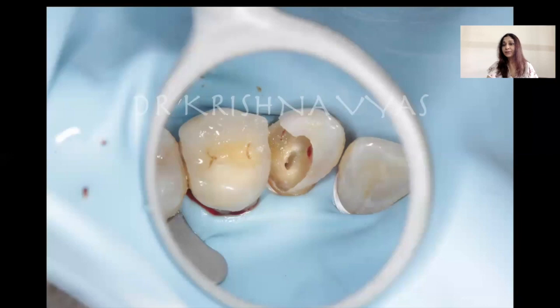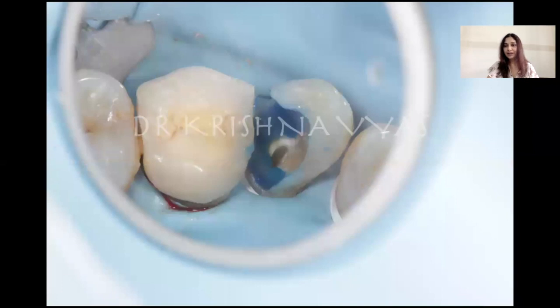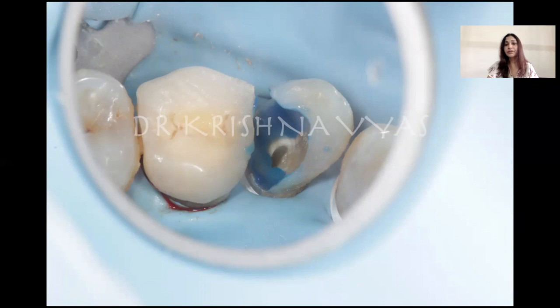I'm going to discuss different types of clinical scenarios with clinical tips. Here we have a canine — a badly decayed tooth. After caries excavation, in such situations the access cavity often opens on its own. First we feel the canal; we don't do complete cleaning and shaping yet, but only enlarge the coronal orifice three to four millimeters, maybe with a ProTaper Gold SX file. Thereafter we do etching, bonding protocols, and place the matrix band. In the three to four millimeter enlarged area, we place a greater-taper gutta-percha — maybe six percent taper or a non-standardized gutta-percha.